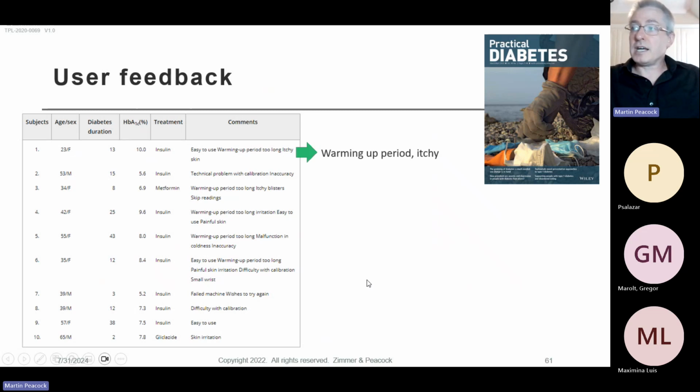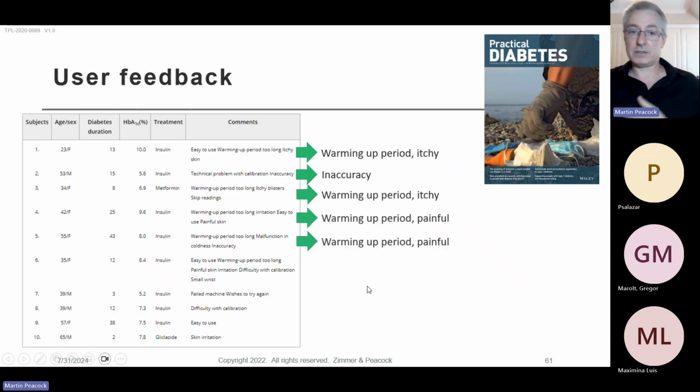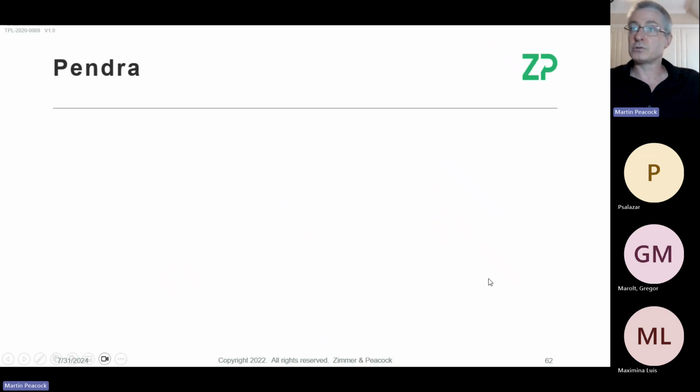So this is some of the reviews they had. The warm-up period is a problem. The itchiness was a problem. The inaccuracy was a problem. And, you know, some of these things are repeated. I did mention it may have been quite painful, and some people have reviewed it as quite painful.